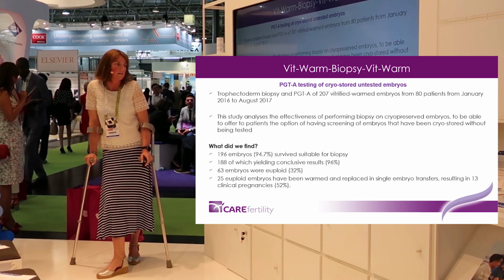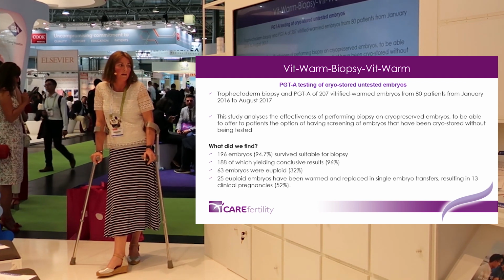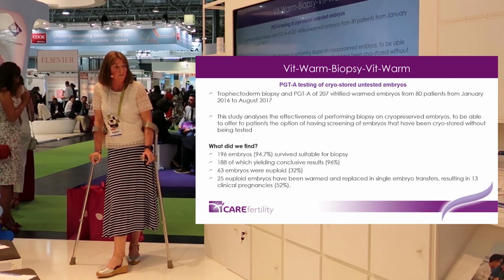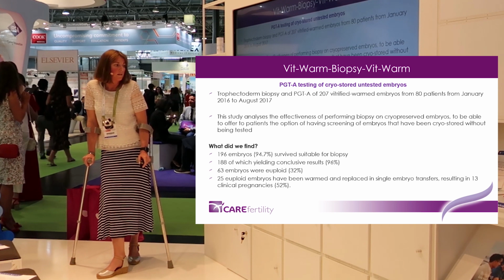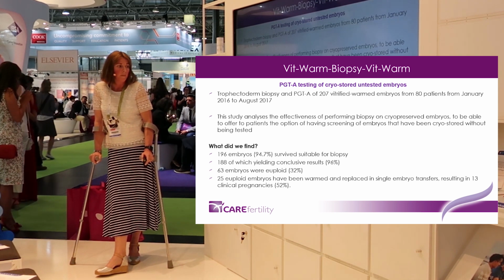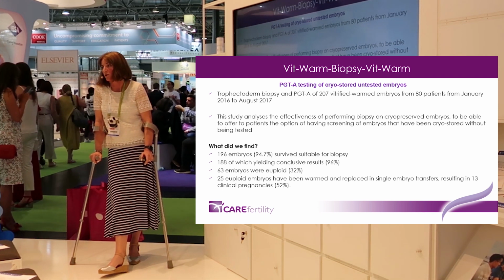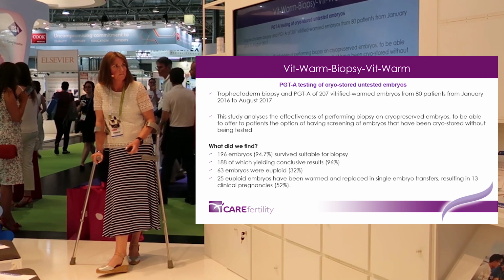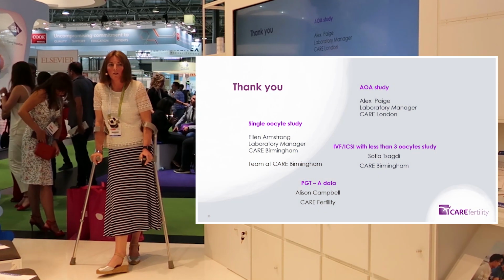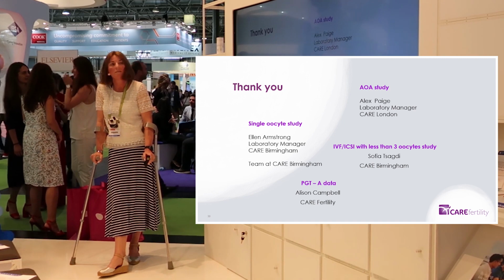And we found that first of all, the survival rate of these embryos was nearly 95%, and there were 32% euploids, which again is in line with the literature, and it has resulted in a clinical pregnancy rate of 52%. So again, that's good information to give to patients to manage their expectations.